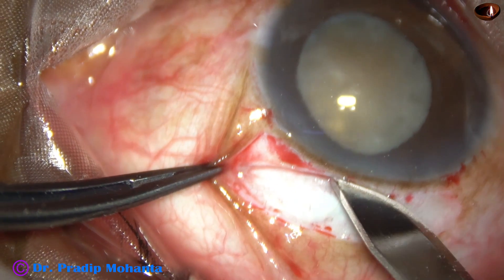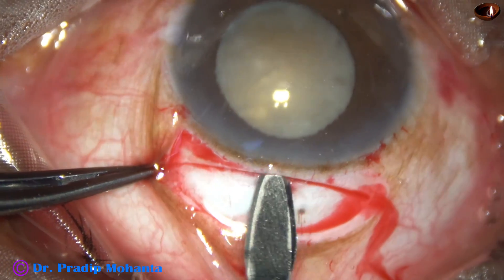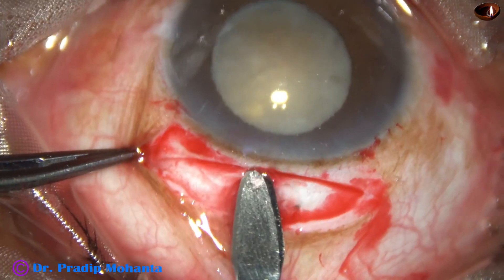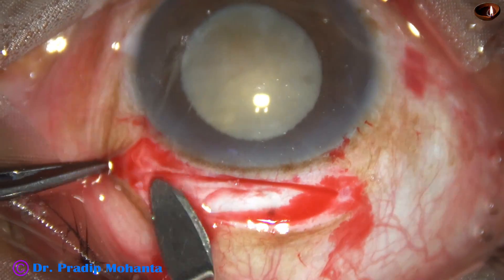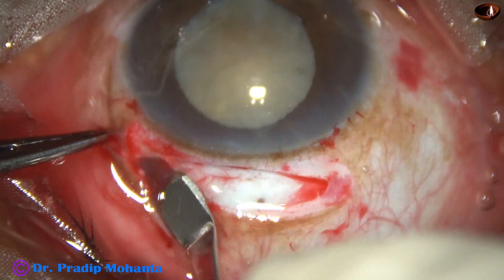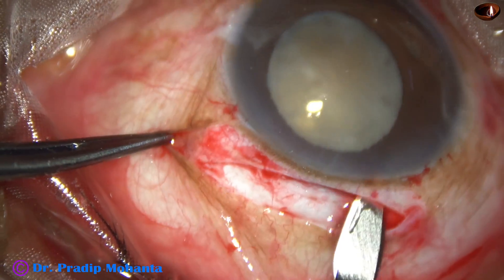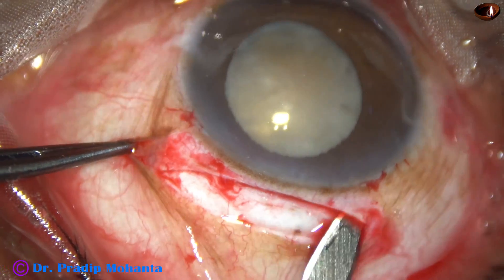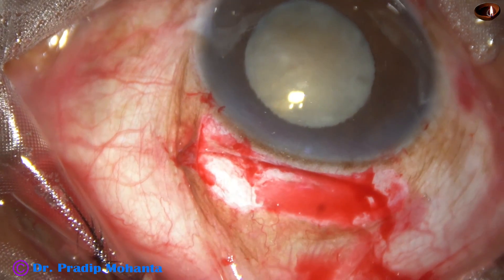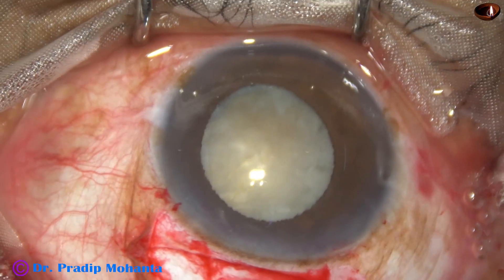The conjunctiva should not get burned by the cautery, as it will shrink and healing will be affected. I make a quite large incision because the nucleus is quite hard — about 7 to 7.5 mm. I make the sclerocorneal tunnel. As I go to the left side, some visco leaks from the side port, and going to the right side, some visco leaks from the main wound.